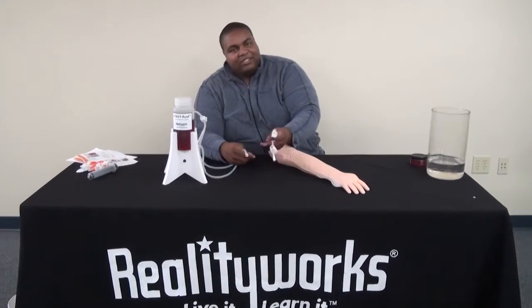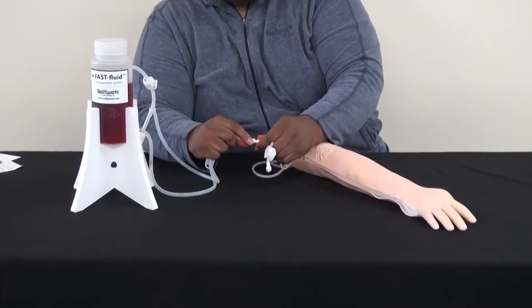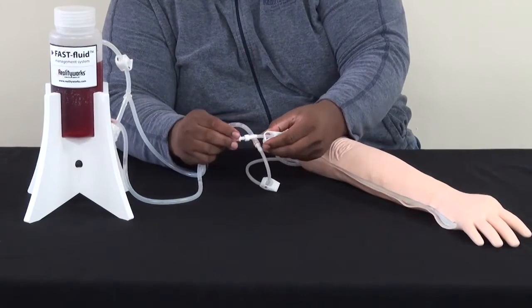First, you've got to connect the tubing to each other. They're keyed and will only go together one way. Put them together with a slight twist. Put the next set of tubes together with a slight twist.